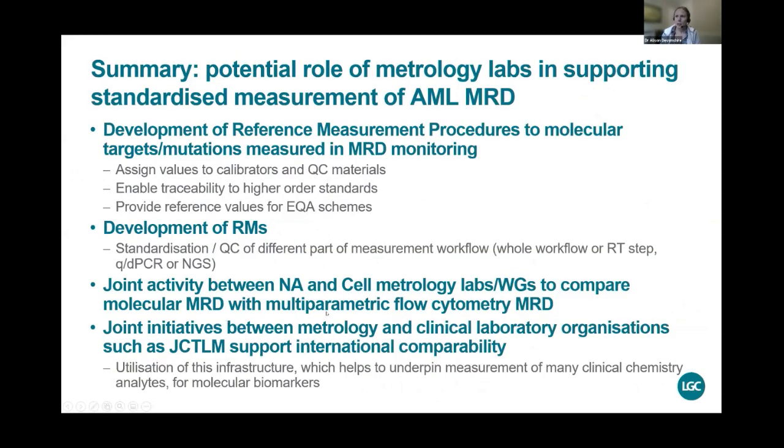So in summary, there are a number of ways in which metrology labs can support the standardized measurement of AML MRD. One aspect is developing reference measurement procedures for the key molecular targets and mutations which are being monitored in MRD testing. This can enable traceable values for the calibrating of QC materials which are used in laboratory developed tests or IVDs, enables traceability, and also can provide reference values for EQA schemes to again allow stability within those systems.